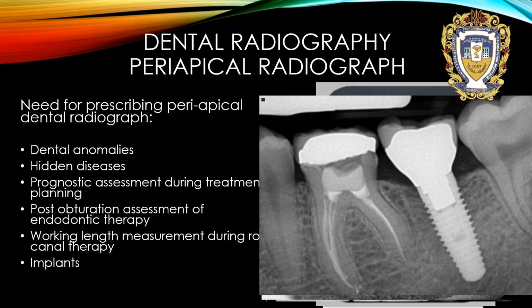And of course, in case of implants, we need to evaluate peri-implant bone, and we need to evaluate bone in the area of the neck of the implant, to be sure that there is no inflammation or some cement from the implant.